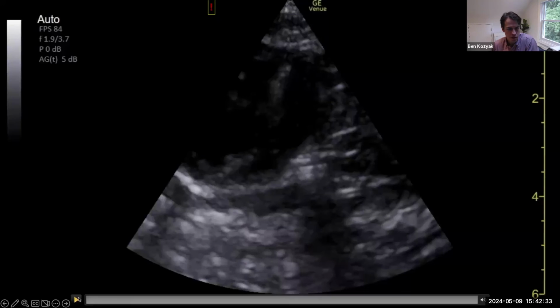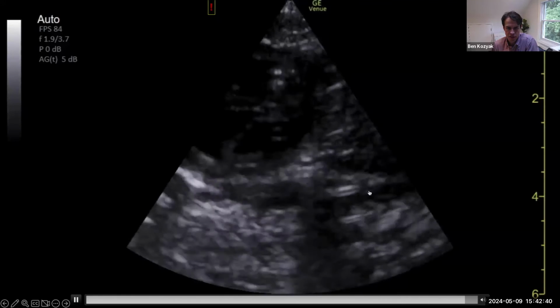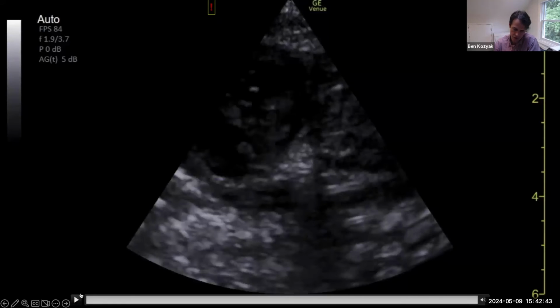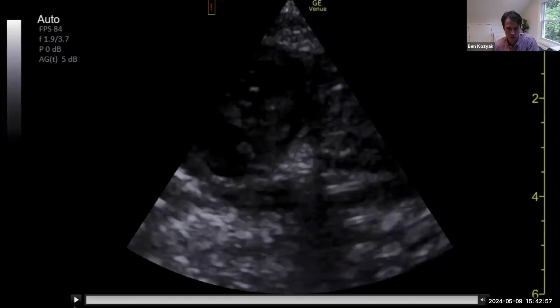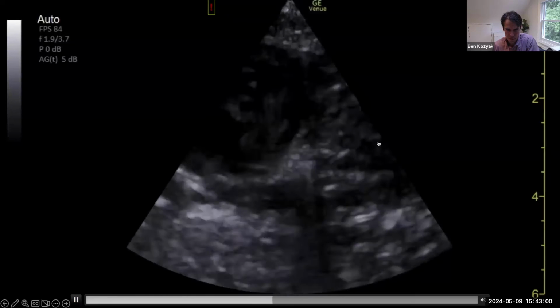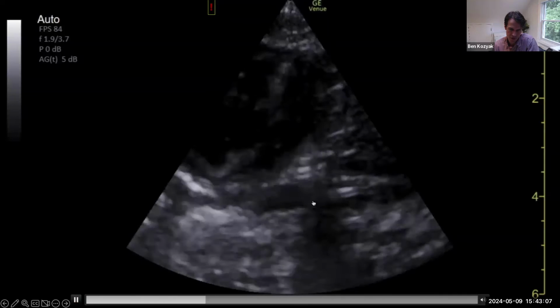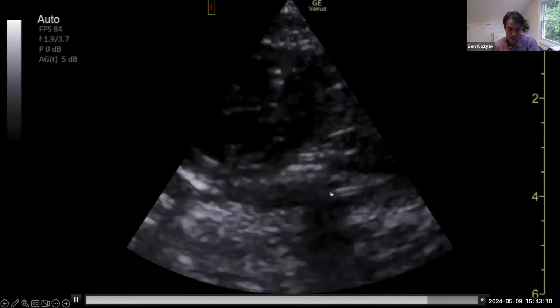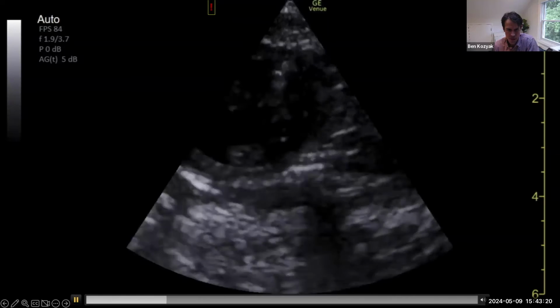In this short video clip, you can see the catheter here. This is a sagittal view. This is basically a straight sagittal and left parasternal. So not left parasternal angulated off to the shoulder, but instead parasternal straight up and down, lined up with the descending aorta. So you can see the heart, you see the diaphragm over here, the liver, and then the catheter bouncing. But right here, that air artifact really obscures the tip of the catheter. Sometimes it's right in there and you think you see it. Sometimes it's beyond. And if you know what to look for, and I'll play it one more time, you can see that the tip of the catheter is actually kind of over here. See it bouncing over there?